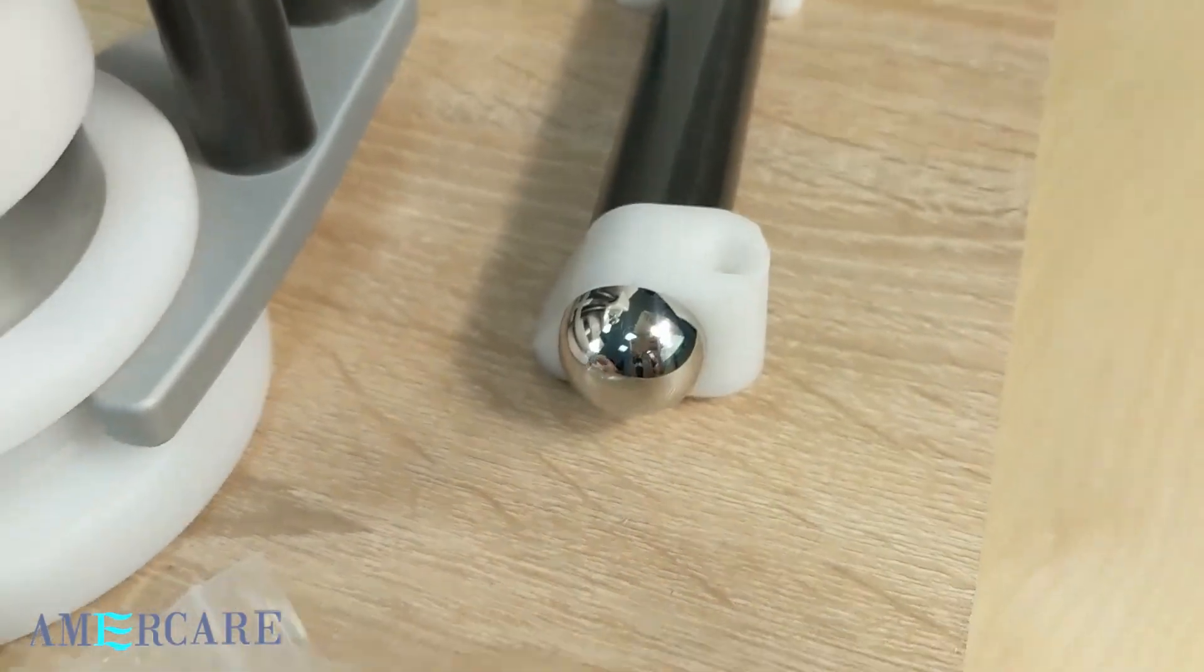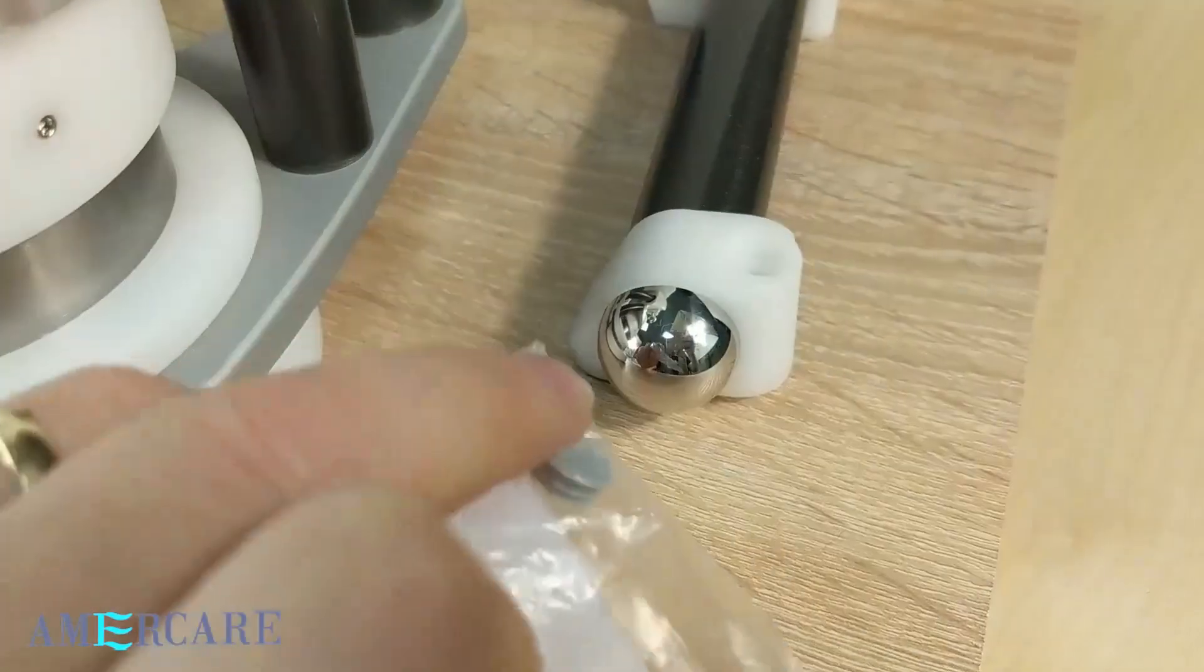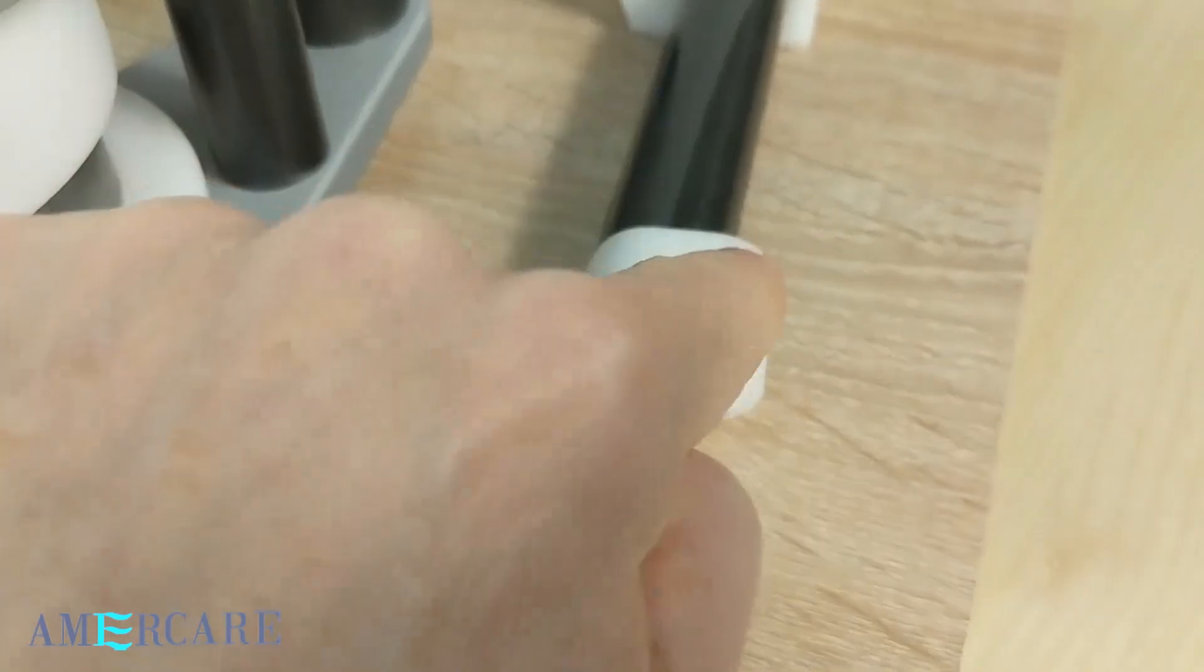With the unit we supply two cover caps. Once the unit is level, simply fit these into the two holes to remove any bug traps.